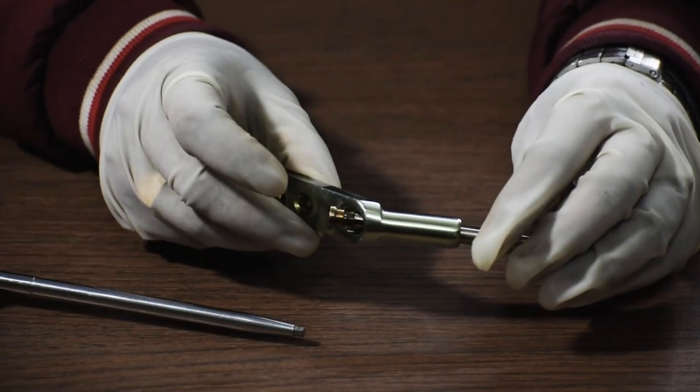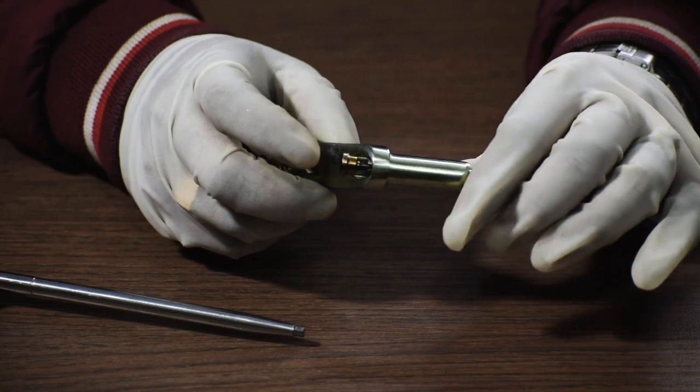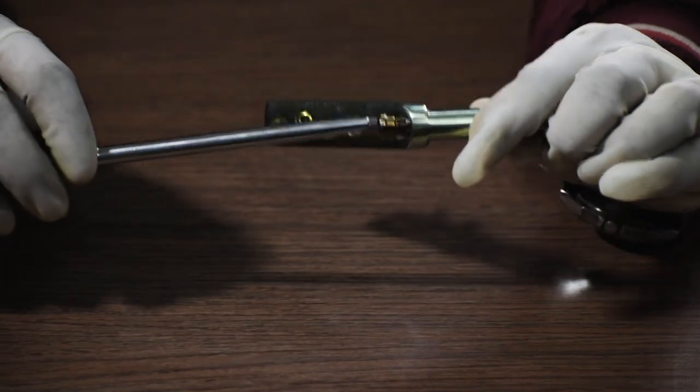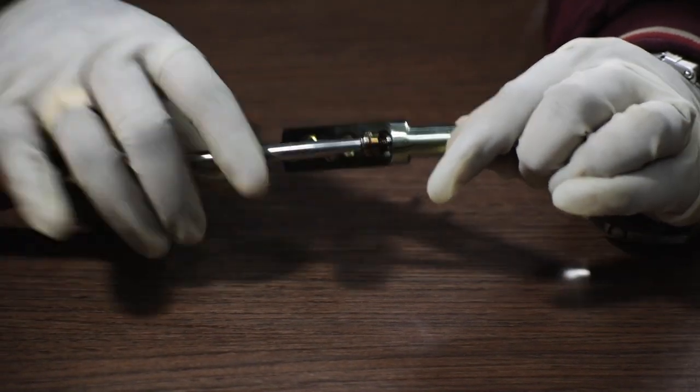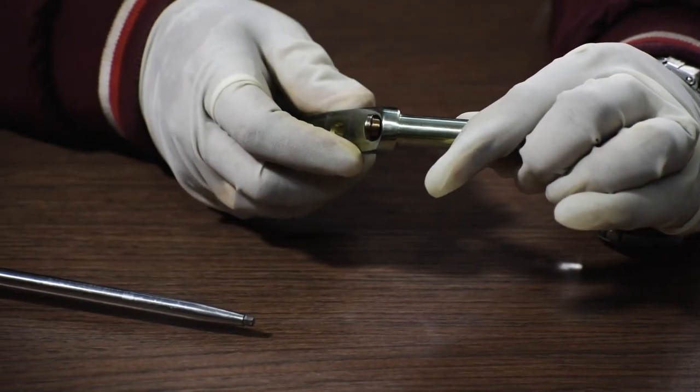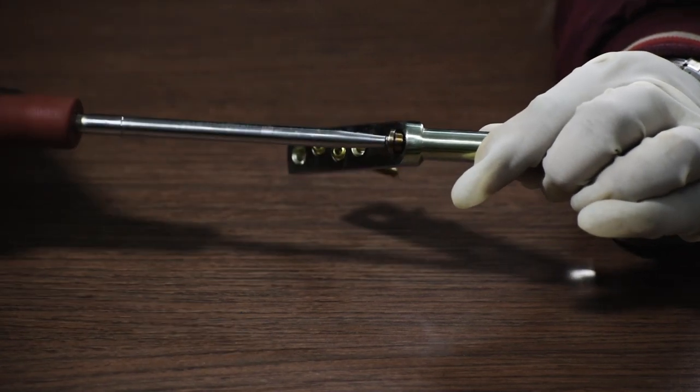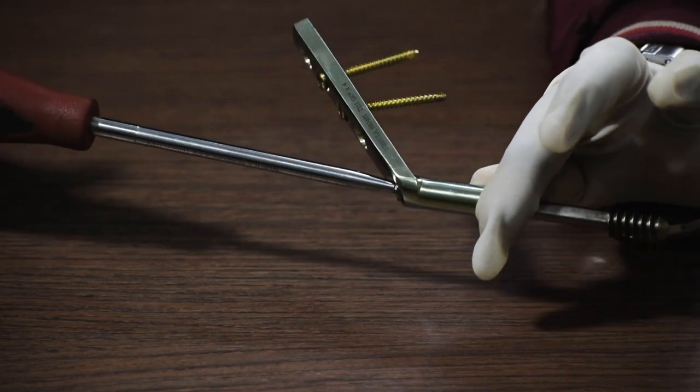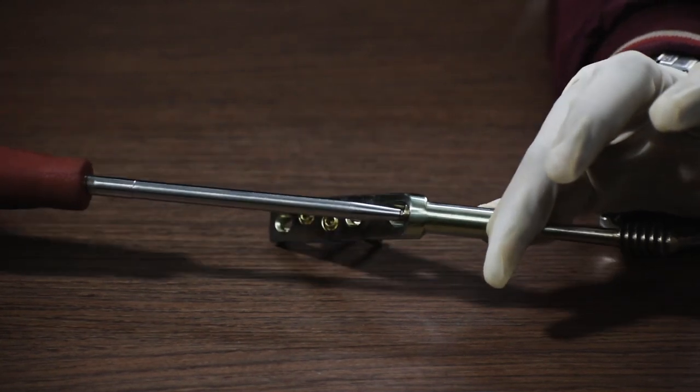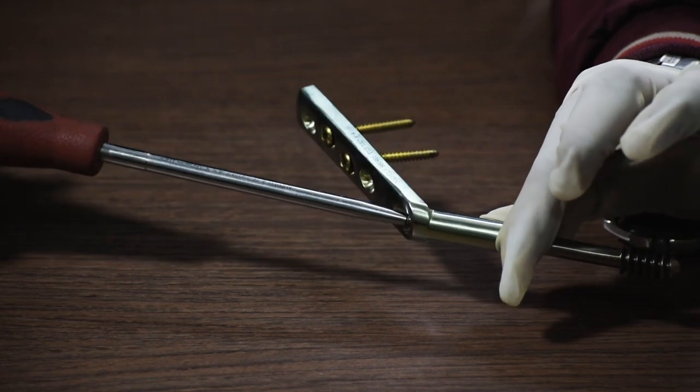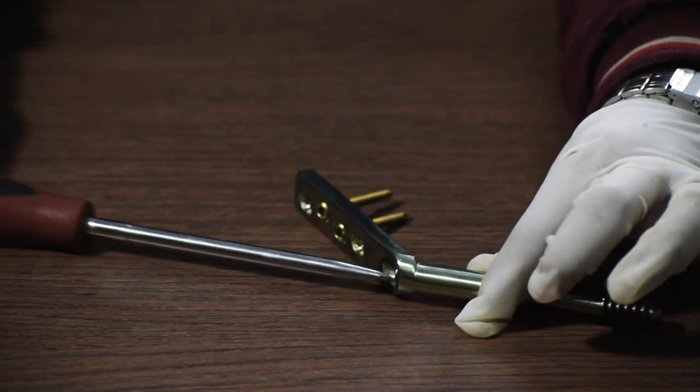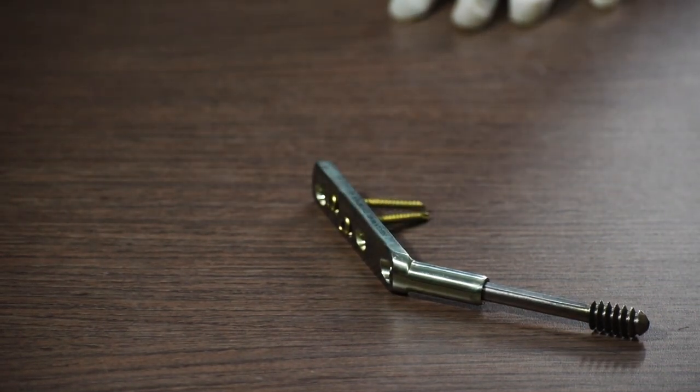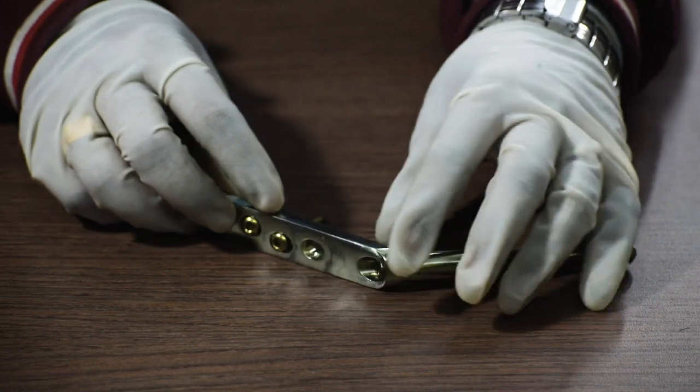If the screw length is such that it is popping out of this barrel of the DHS plate, the compression will be comparatively lesser from the one which just about covers the size of the barrel. This concludes the procedure of fixing a DHS plate.